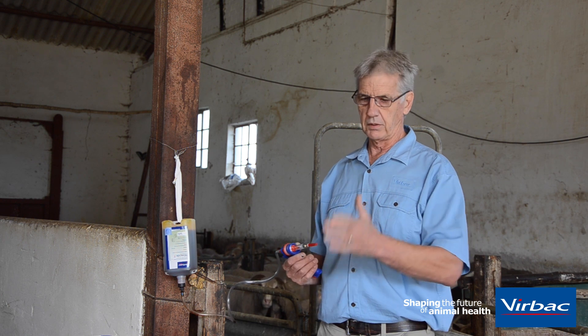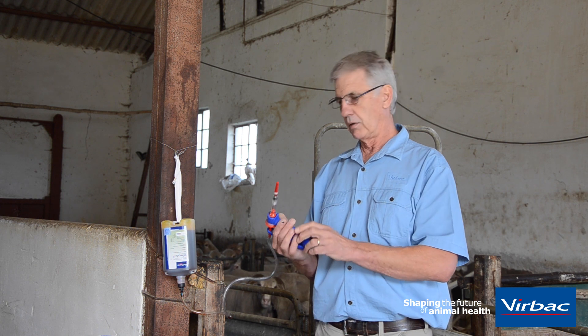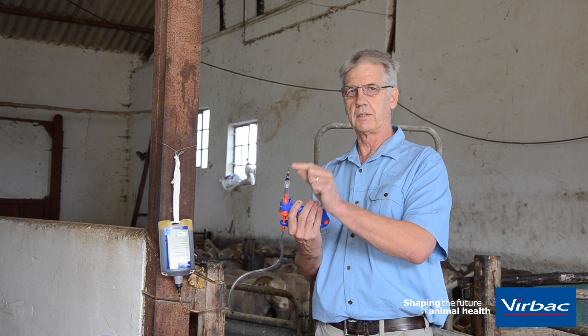When it comes to equipment, always make sure that the equipment is in good working order and that you have enough sharp needles. When filling up the syringe, make sure that you get rid of all the air bubbles. We are now going to inject a product called Biocyte F, which is very yellow and can lead to staining. So I've chosen a longer needle — a three-quarter inch needle — to make sure that you don't get leakage. Leakage is a problem even with other products like vaccines: if you only inject one cc and you lose a few drops, you're not getting the full dose. So rather use a slightly longer needle and do a proper job.